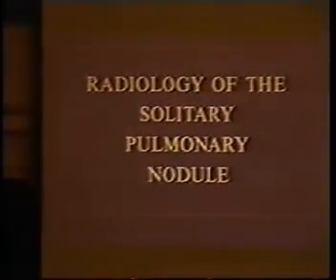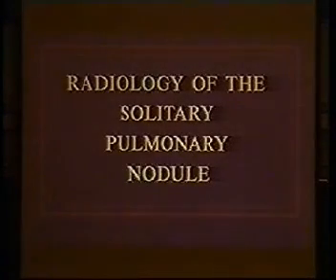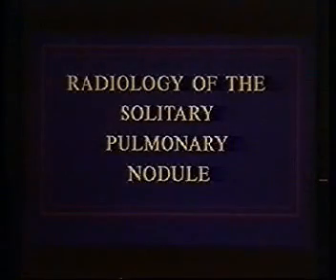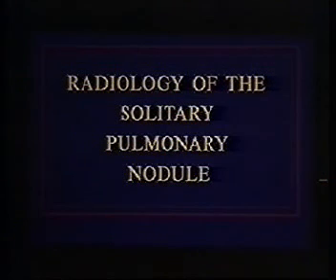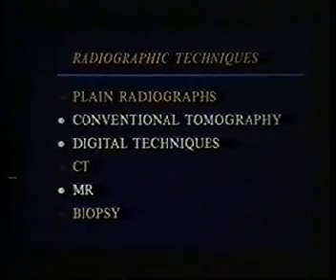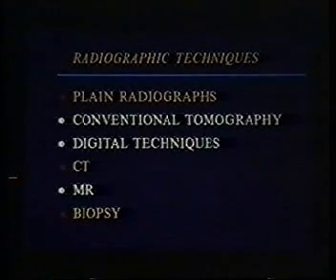This morning I'd like to talk a little bit about the current radiological evaluation of the solitary pulmonary nodule, and this is indeed a common diagnostic problem in current radiologic practice because of the ever-increasing incidence of lung cancer in the population. And over the years, a number of radiographic procedures have been brought to bear in the diagnosis of solitary nodules, and I'd like to review specifically several of these.